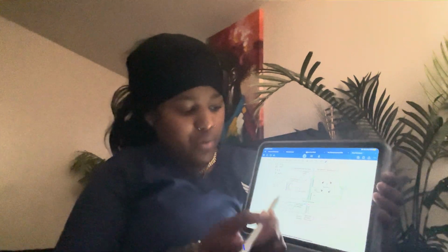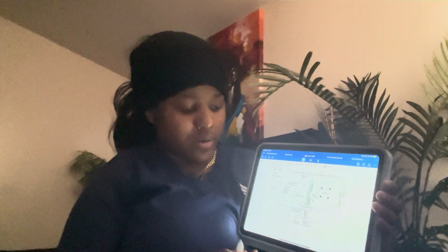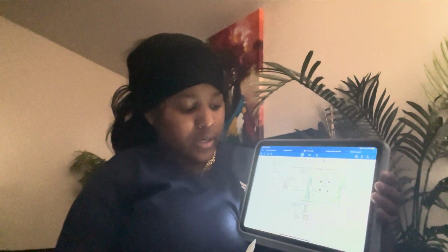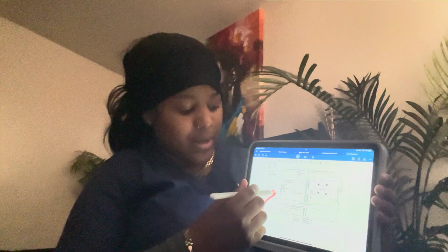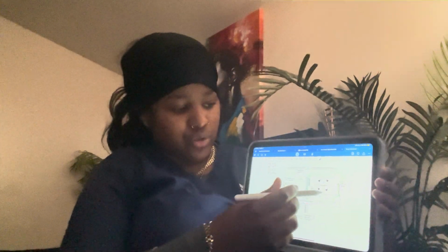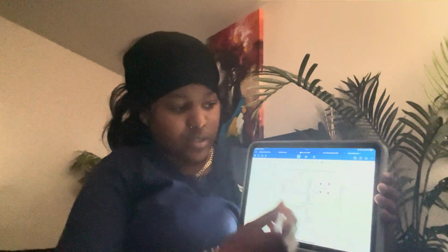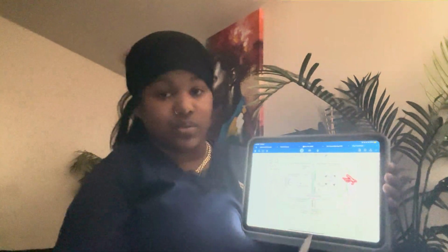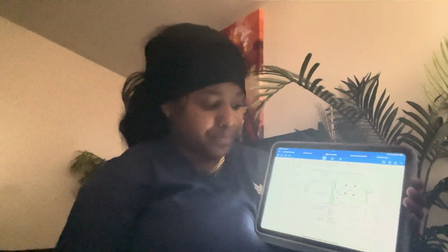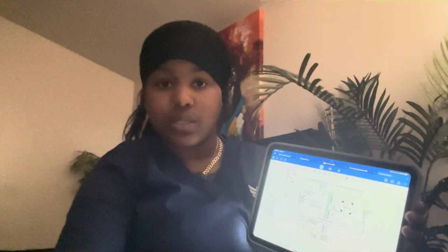So you may wonder what even is an X-ray circuit and why is it important? The X-ray circuit is basically a pathway that allows the X-ray machine to accept current and control and modify the power to run through this circuit, to be able to produce X-rays. It's very important. So with the low voltage side, we have the main switch.